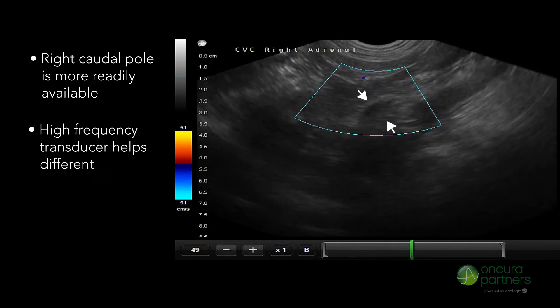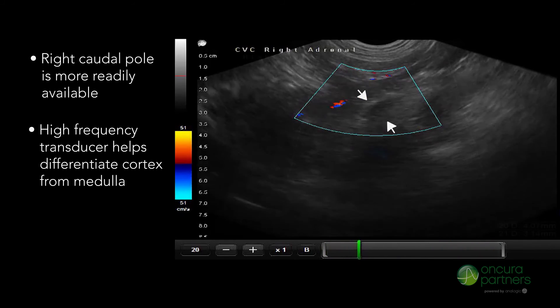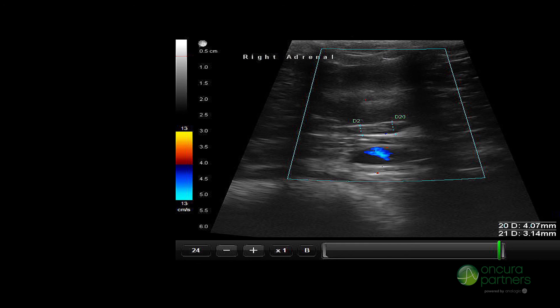Using a high frequency transducer will help to differentiate the cortex from the medulla. Make sure to measure the widths of the cranial and caudal poles respectively, in order to compare them to normal reference points.